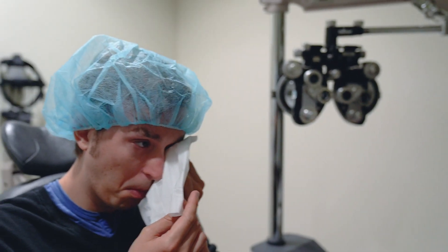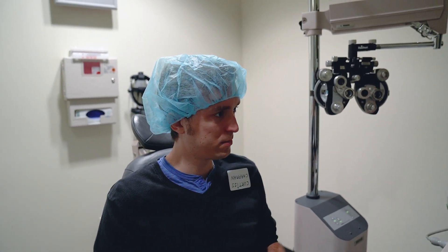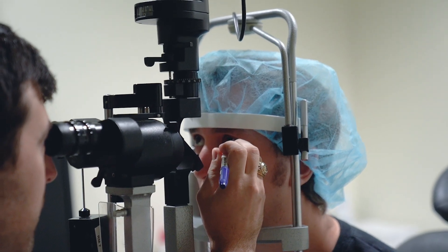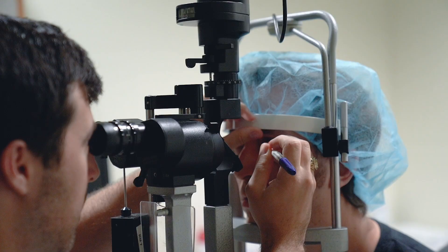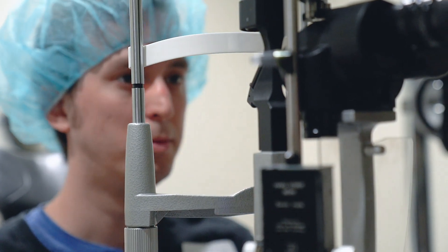Numbing will wear off in about 15 seconds. So a big part of what we're treating for you today is what's called astigmatism. And since we're treating your astigmatism, I need to make a few marks on the eye just so we can guide Dr. Mayo during the procedure — make sure we're accounting for any rotation during the procedure. Go ahead and look up towards the ceiling. Good. You can sit back. Looks awesome.